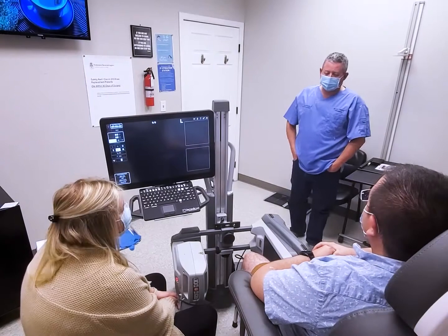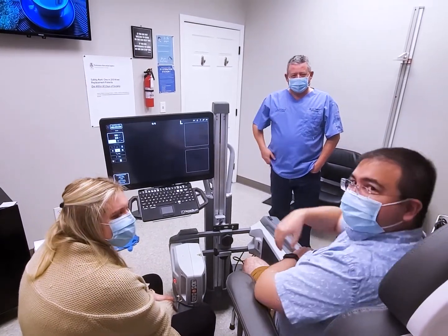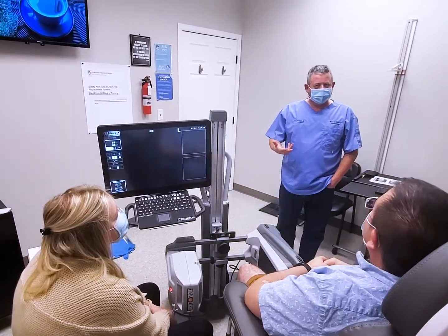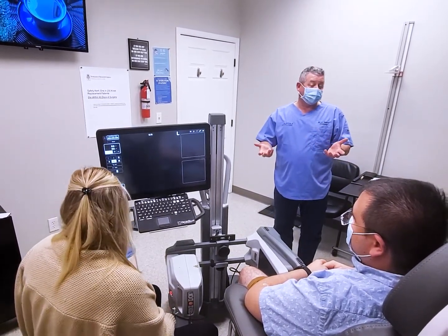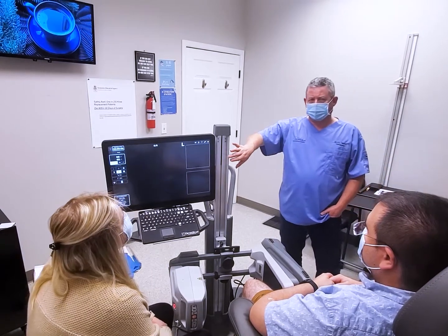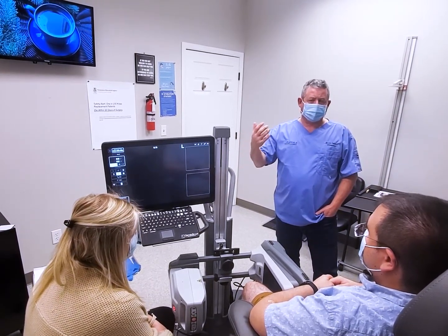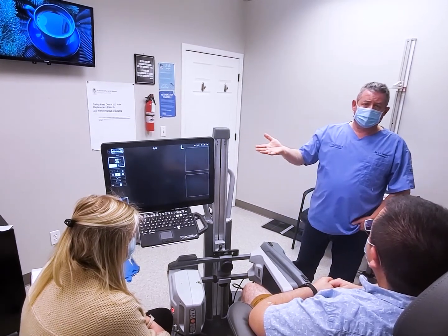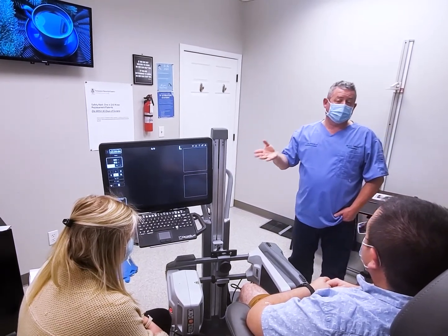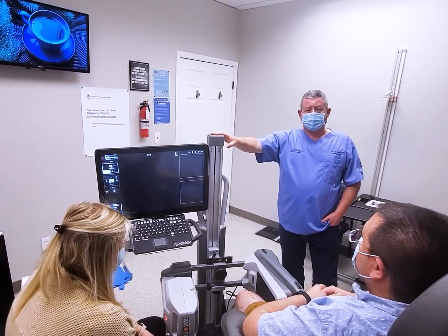All right, we are going to do the actual injection on Johnny. Johnny, turn around and say hello to everyone. Hello. This is just an opportunity to see what actually happens with an injection, to take the fear out of it for people. We talk about imaging being so important, partly for the patient's comfort, they can see what's happening, but also so that our practitioner has the ability to see where she's going with the needle, make sure we never miss, we're always in the right location, and without imaging, that's pretty impossible to do.